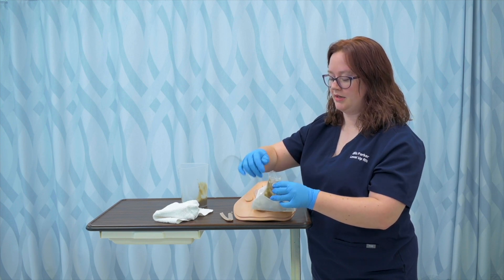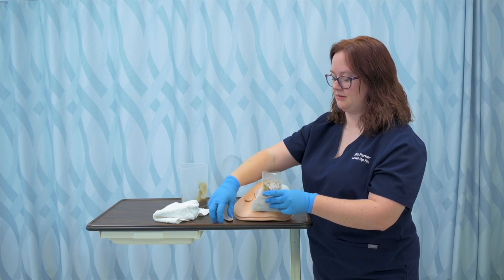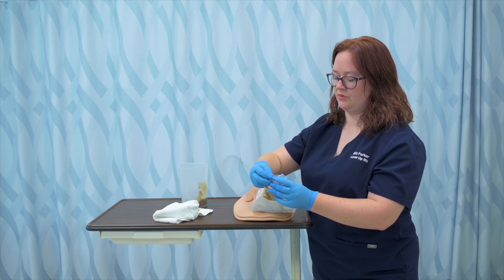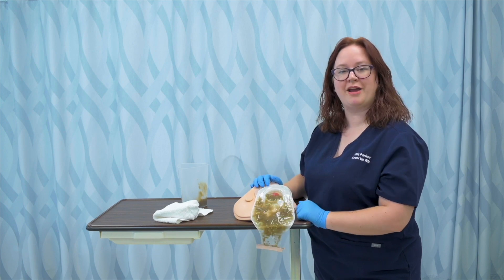I'm going to then uncuff the bag. I can see that that bottom piece is free of stool. And I'm going to recuff the bag so that no leakage occurs. And I've emptied my ostomy.